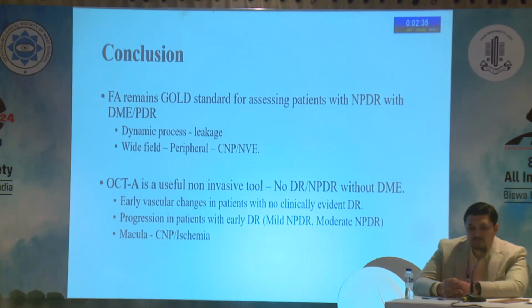and I think most of the current literature does suggest almost the same thing. But in my opinion, especially in today's scenario, if you give me a choice, I would still like to go ahead and do ultra wide field FFA. If I just have a normal FFA, conventional FA, I would probably go ahead with OCTA and not do conventional FA. But the amount of knowledge that ultra wide field FA provides is not provided by the currently available OCTA machines.